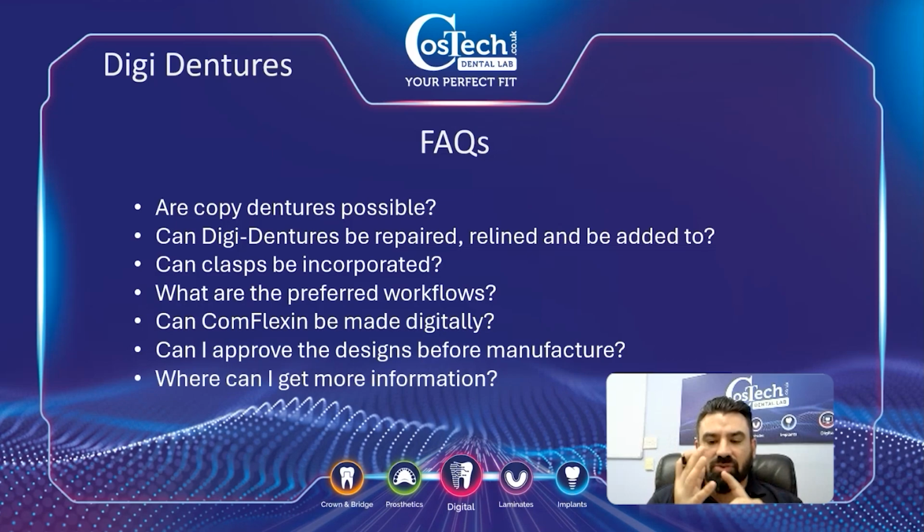So people with acrylic allergies and monomer allergies, you're still going to have the same as with traditional dentures.